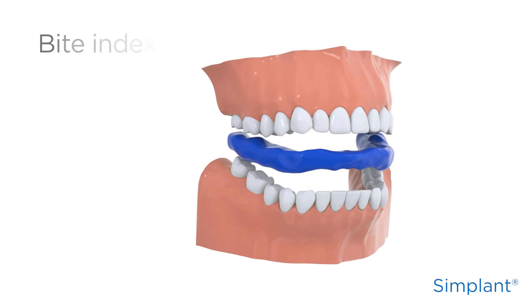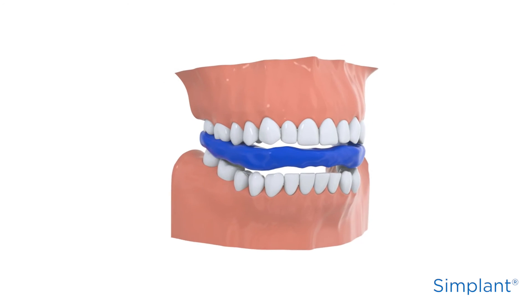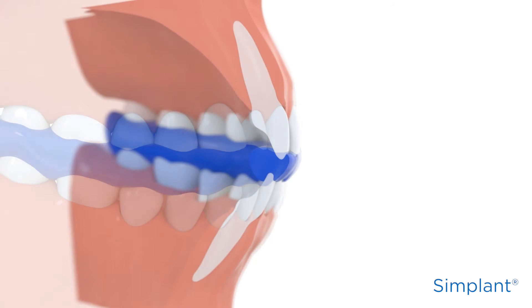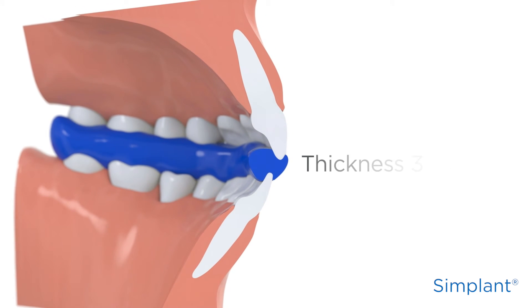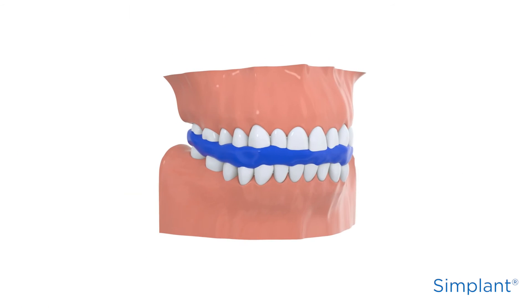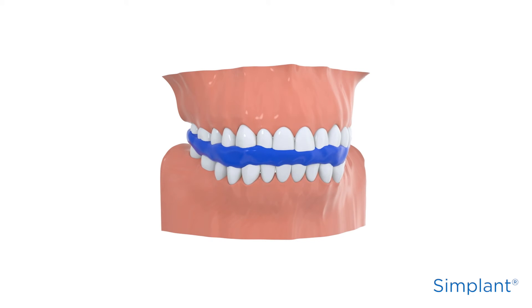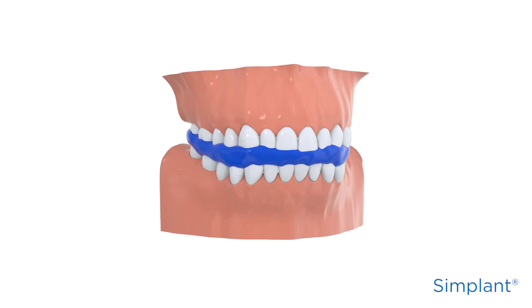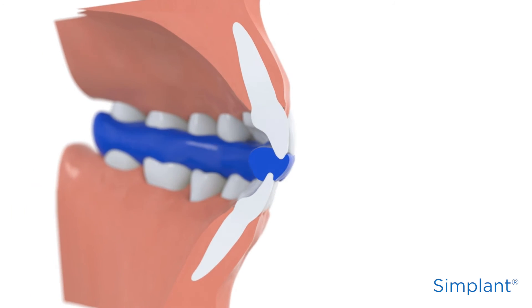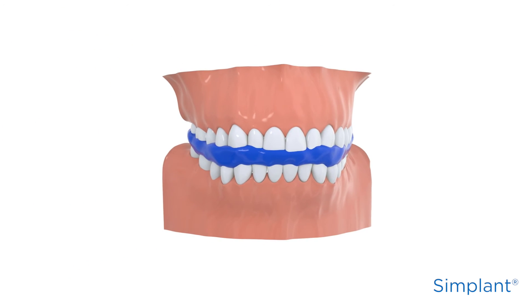Now, the bite index. You definitely need to use one, as it separates and stabilises the jaws at the time of scanning the patient. The thickness of the bite index should be between 3 and 5 millimetres. Remember to make sure it's radiolucent. Don't throw away the bite index after the scan — you can reuse it to accurately position the Simplant guide later.